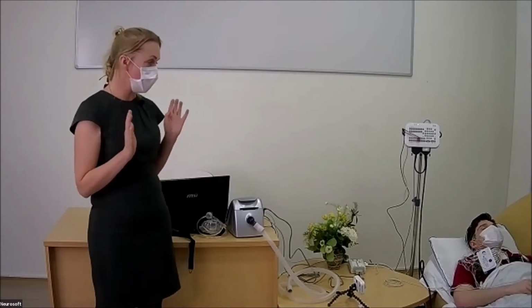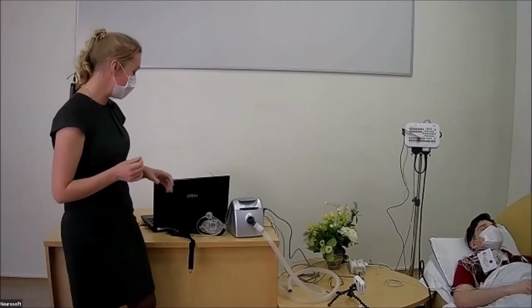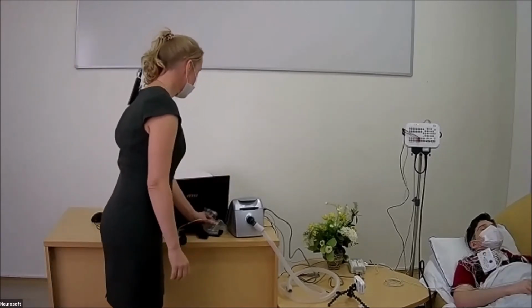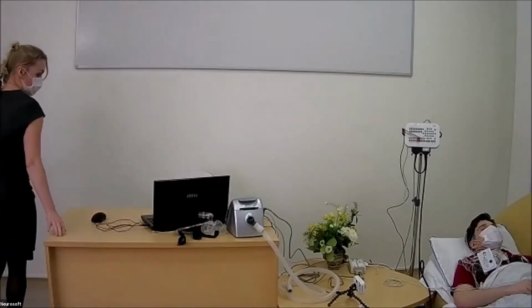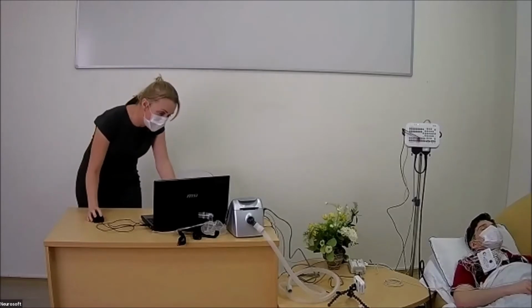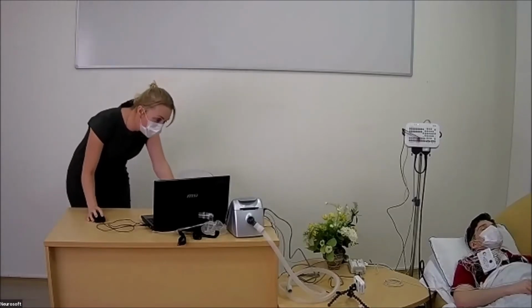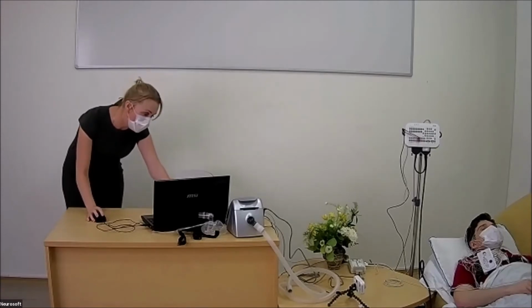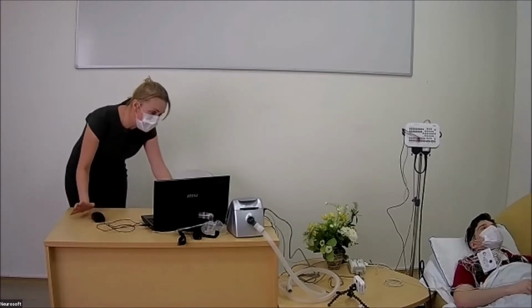But we should put the mask on our patient. It is the first thing that we need to do. So I stop our recording, and we will show this recording in some seconds.